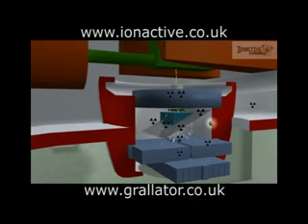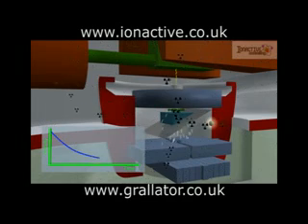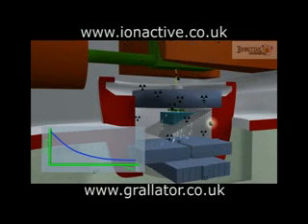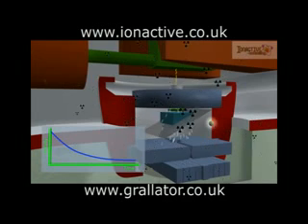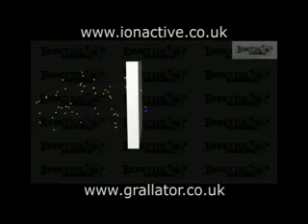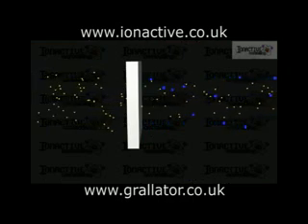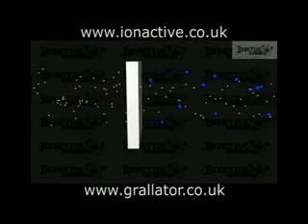The activated materials in the treatment head can deliver a dose to staff dismantling the head for setup and maintenance. The activated products are usually short-lived, so any radiation hazard during dismantling can be reduced by waiting for several hours after the last irradiation has finished. Because of the short half-life, it is unlikely that a significant build-up of activated material will occur. When the LINAC is used as an electron source, similar reactions can occur whereby an electron is absorbed and a neutron is released. The reaction probability for this is much lower than that for X-rays.